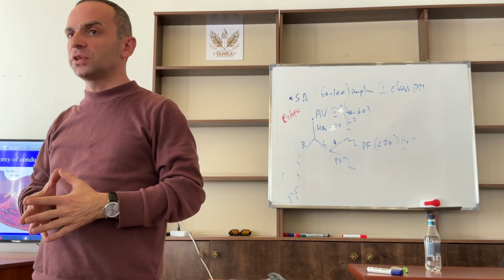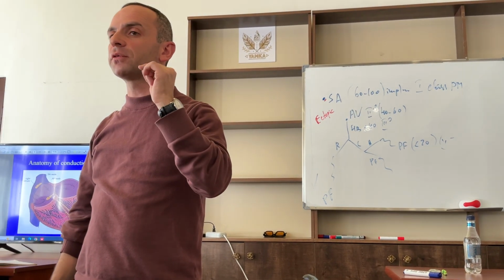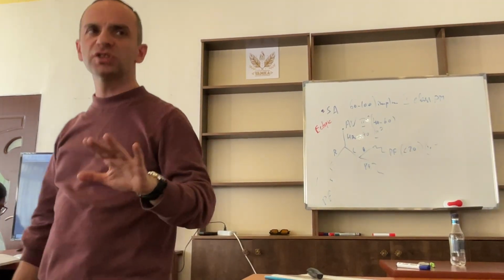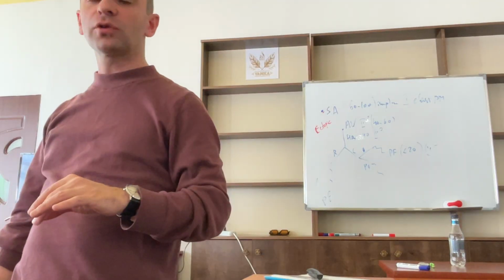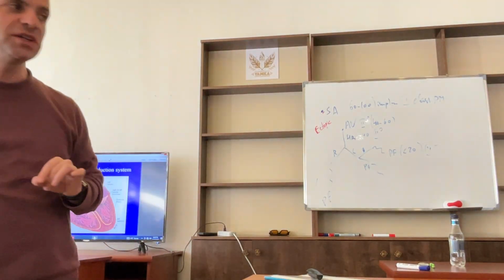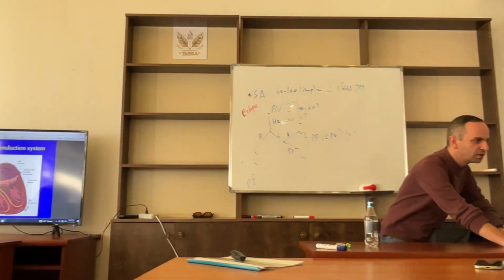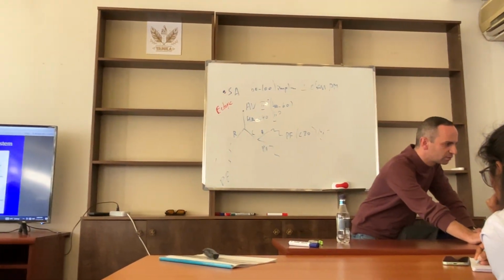So, in other words, all these ectopic rhythms are called, write down, passive ectopic or escape rhythms. Here we are not speaking about arrhythmias.